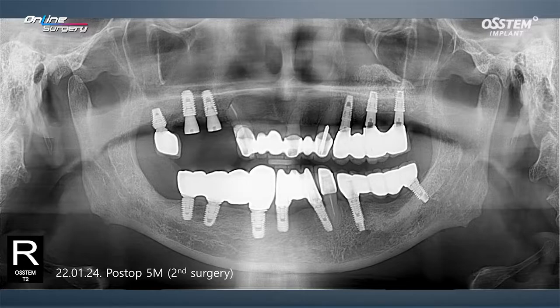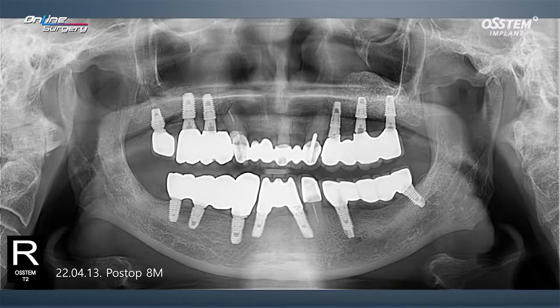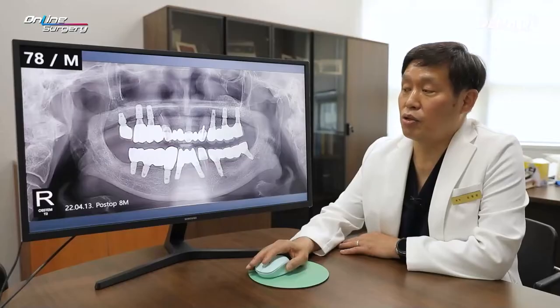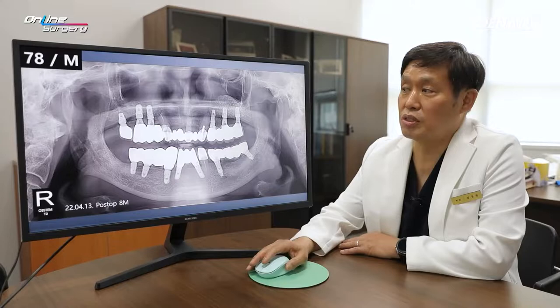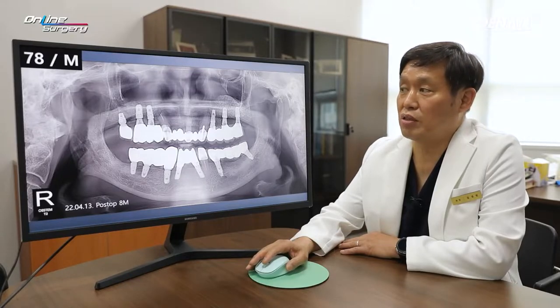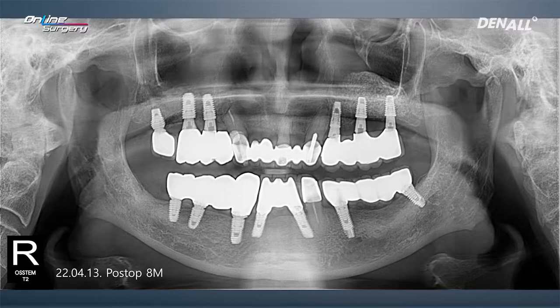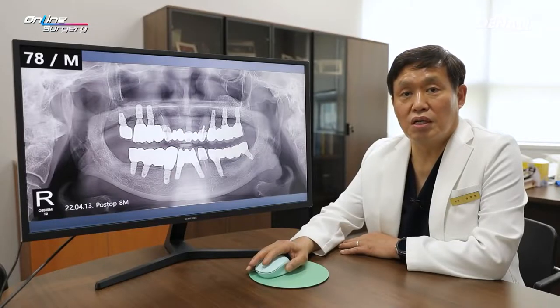A secondary surgery was done, and approximately eight months later, it's been about two months after prosthesis was loaded in the upper. The prosthesis was delivered for the lower as well, and the main complaints when the patient came in were addressed. The implants placed by a different dentist will be maintained. This is how the treatment was done. I'm going to show you the surgical clip.